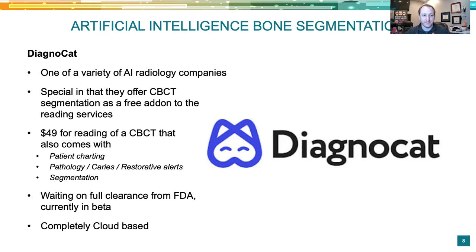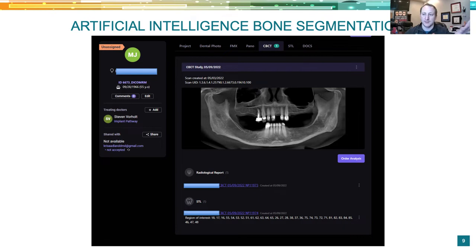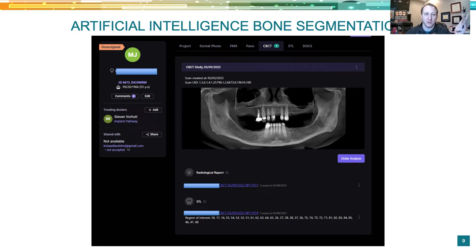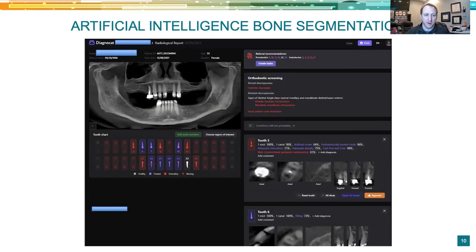Inside the cloud software, you log in and upload a patient. It draws the panoramic curve and gives you a rendering right away. You can order different analyses. There's a radiological report for CBCTs — a long-form PDF — and an STL option. The radiograph report charts missing teeth, treated teeth, and unhealthy teeth: red teeth are unhealthy, blue ones are treated, and red X'd-out teeth are missing.